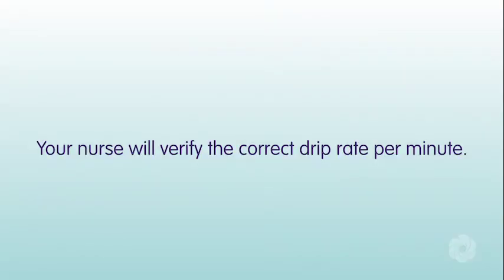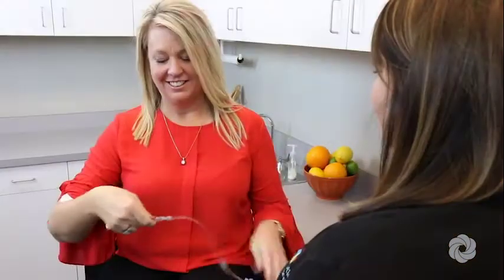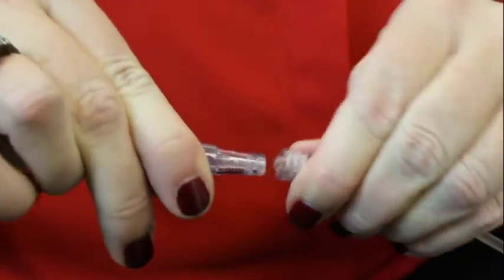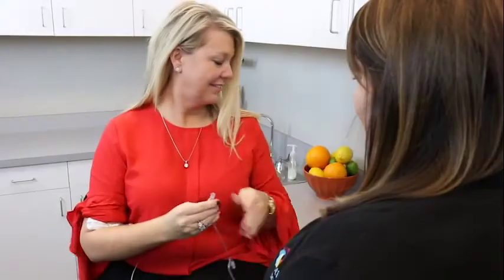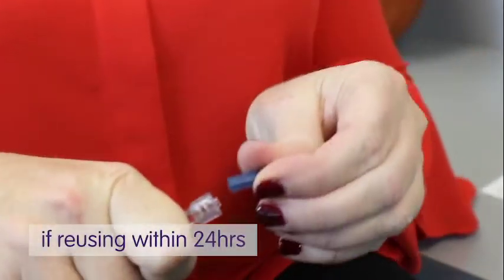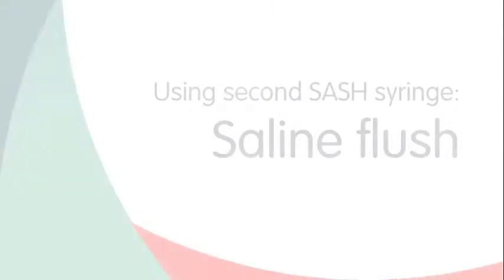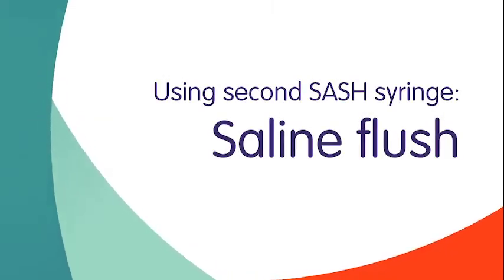Your nurse will verify the correct drip rate per minute. Once the prescribed dose has infused, close the clamp on the IV tubing. Disconnect the IV tubing and discard all equipment as instructed. If the tubing is to be used again within 24 hours, cover the exposed IV tubing tip with a sterile cap provided. You are now ready to flush your IV line with saline again.